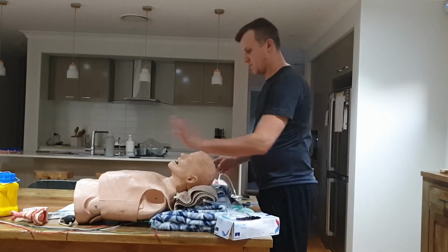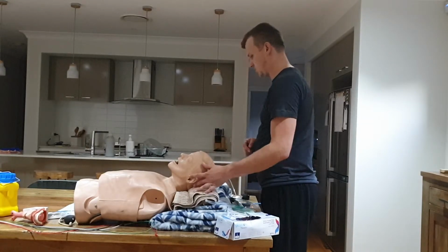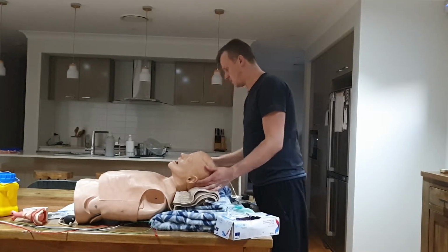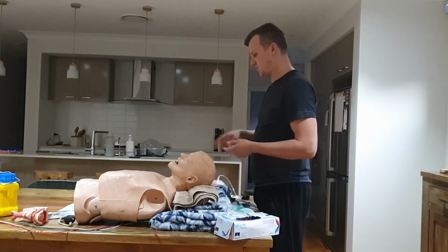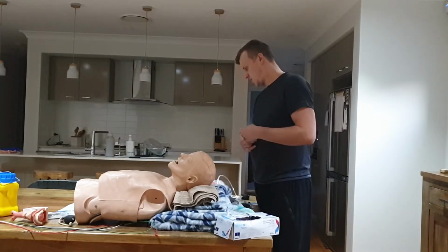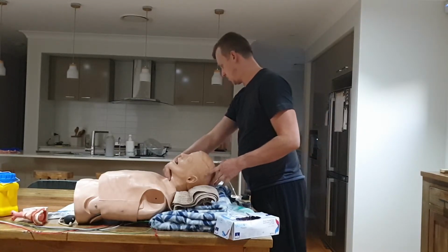And then make sure they have intravenous access as well, so we can start to introduce the drugs and medications. I'll start to move into the skills side in a second, but just for the key documentation points, document how many times you attempted intubation, if there's any contingency plans, the amount of drugs given to the patient, what made it difficult, any positive or negative reactions, and if the cricoid pressure or the Sellick maneuver was performed.